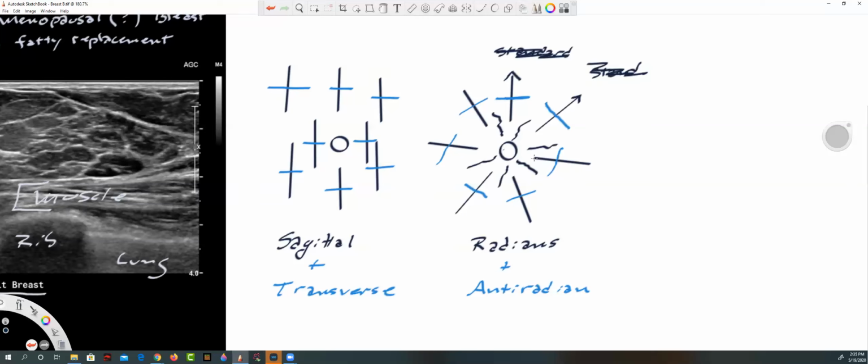So at this point, what I do, and I talked to Melissa, and she does the same thing: switch your transducer. And then at some point, once again, switch your transducer. So it does get a little confusing.